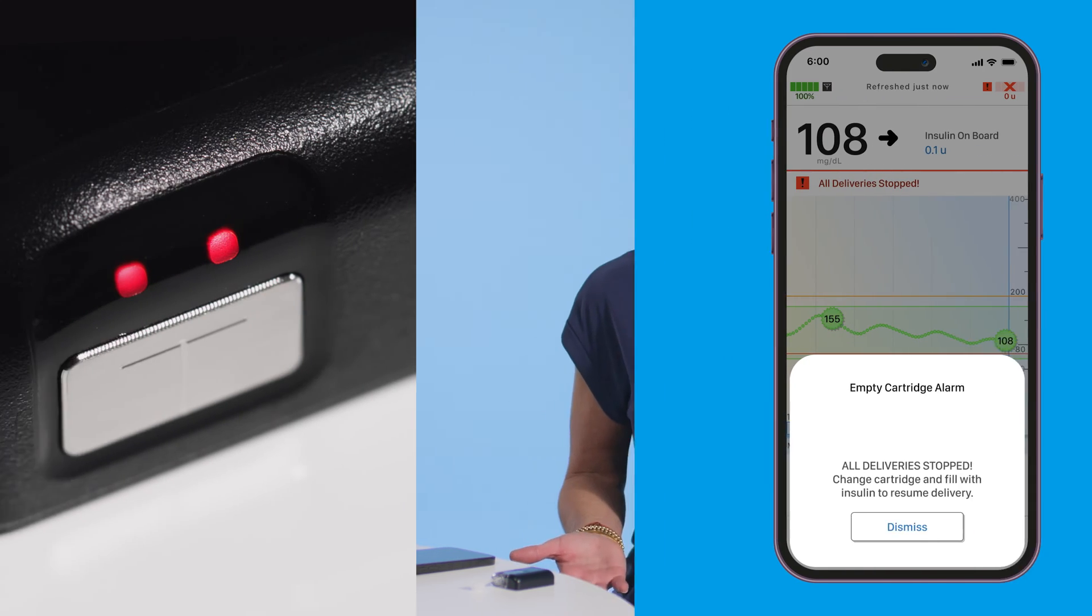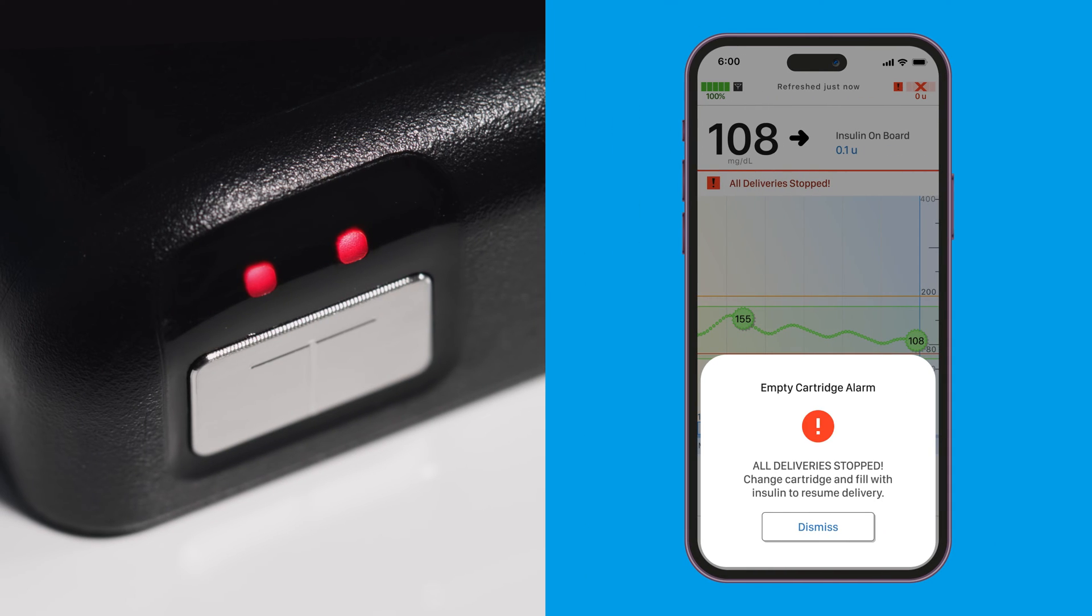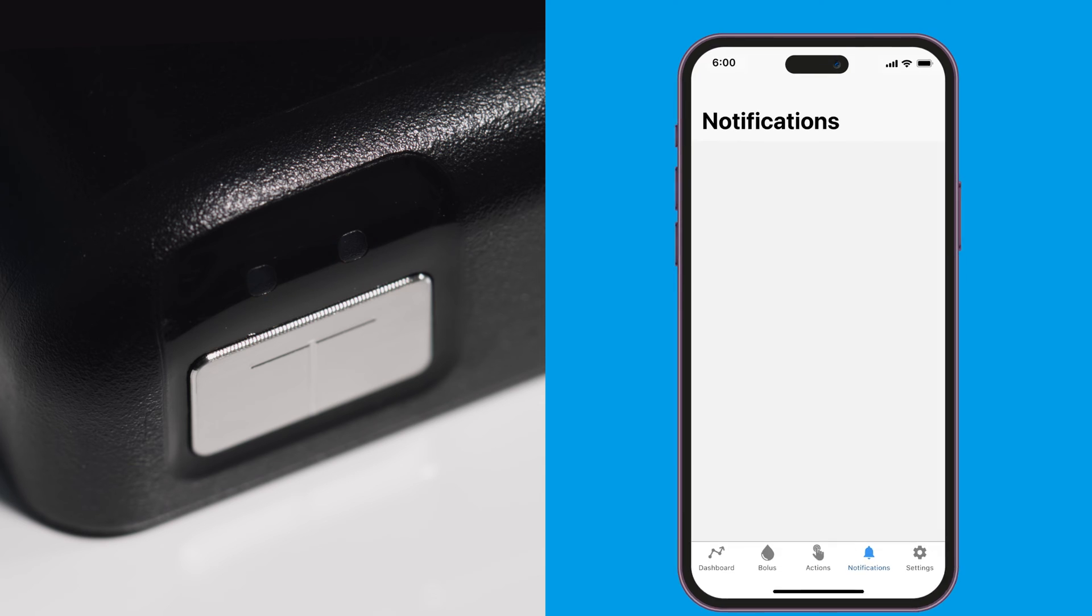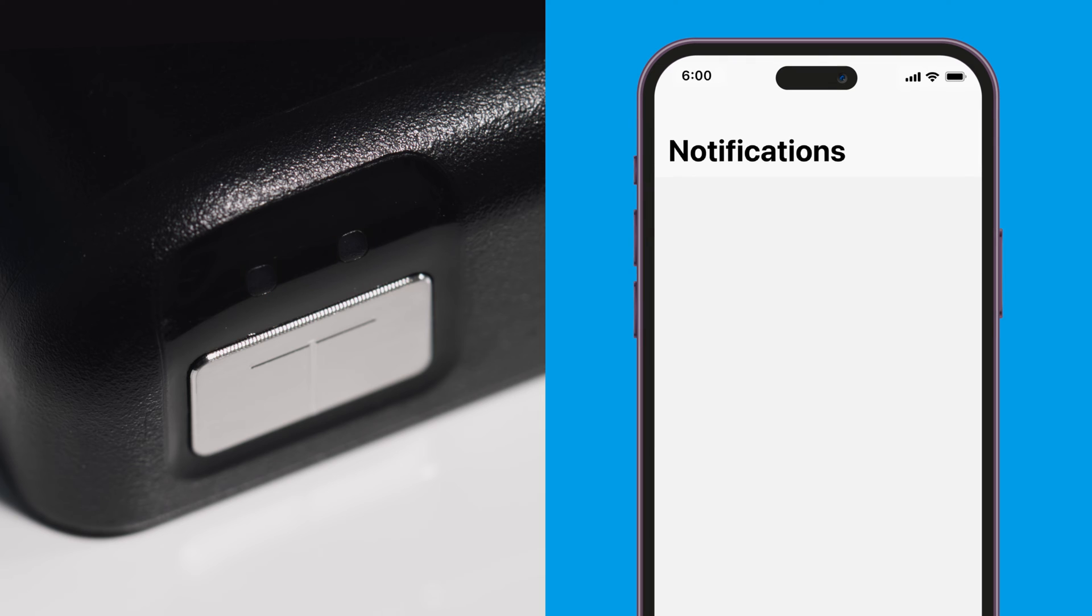Each color has a different meaning. Red represents an alarm or malfunction. This means that all insulin delivery has stopped. If you see this, please check your pump as soon as possible.